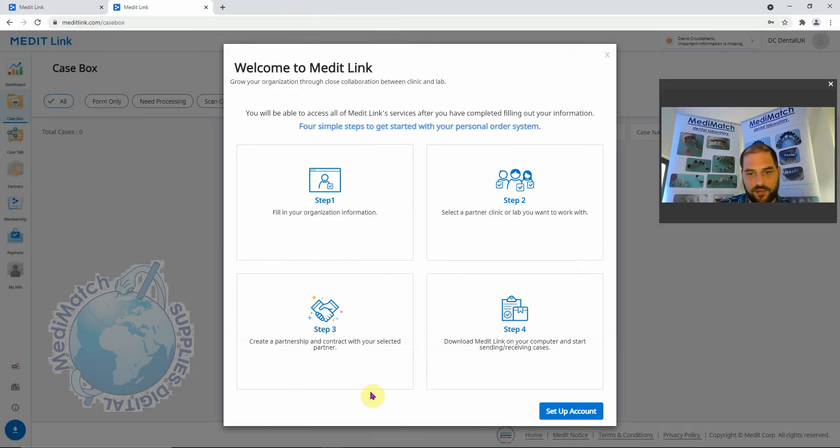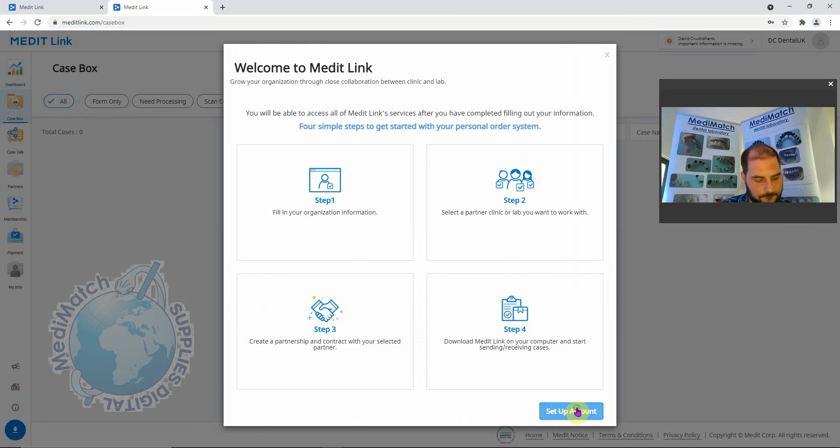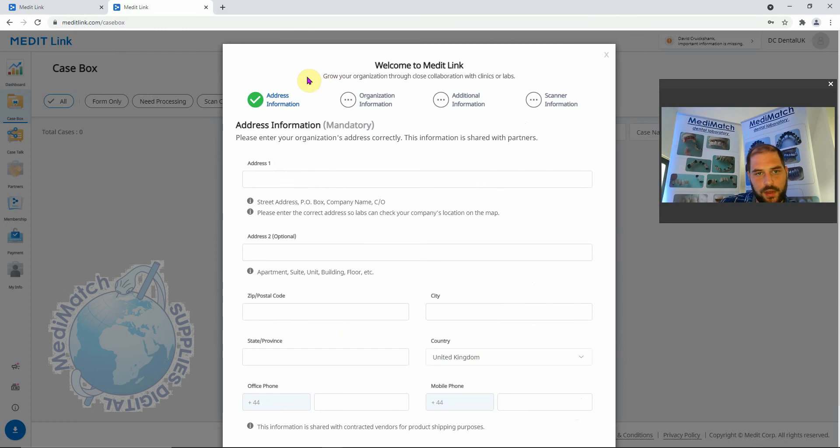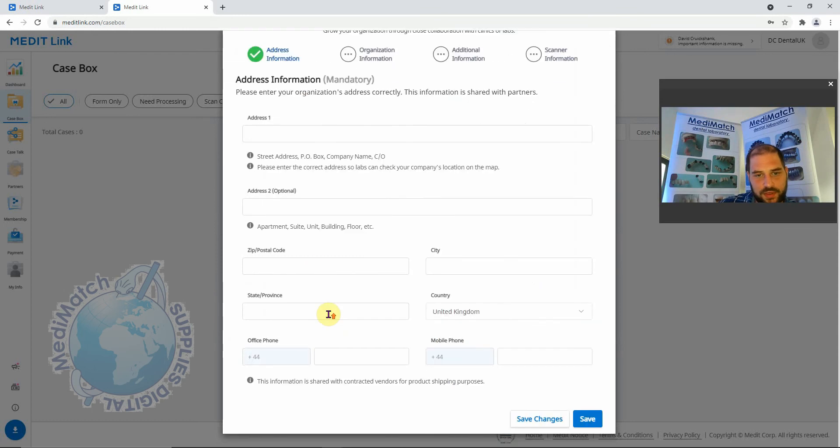We're just going to finish the setup account process and click this button here. All this information is mandatory, so we're going to go ahead and fill it in.